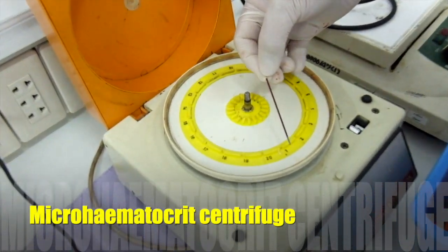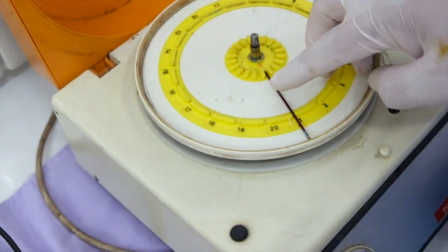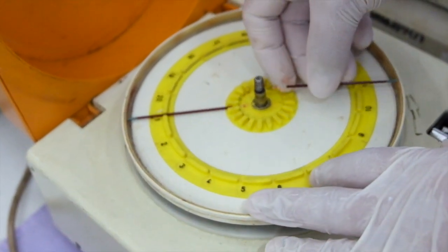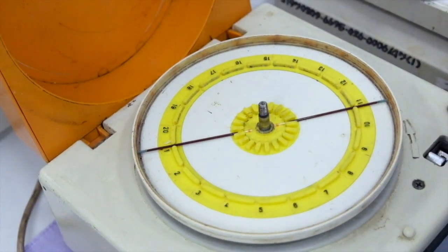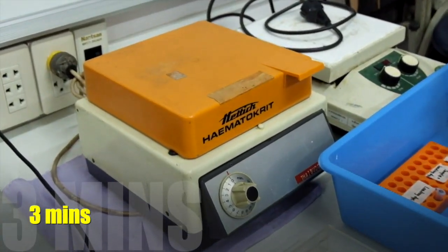Place the filled capillary tubes in the microhematocrit centrifuge in the opposite position to each other, and the clay plug tips orient away from the rotating core. Tightly close the lid of the centrifuge and spin for 3 minutes.